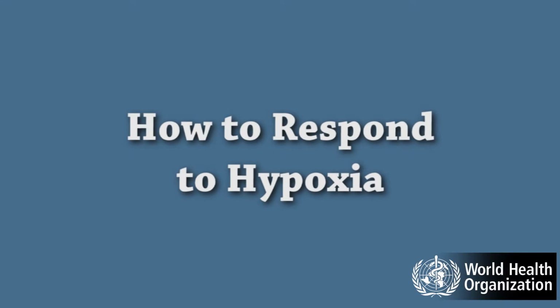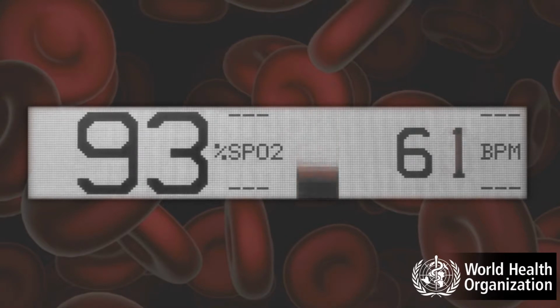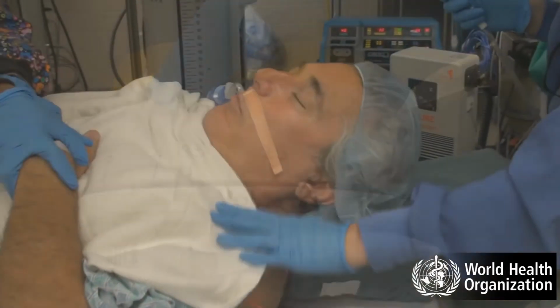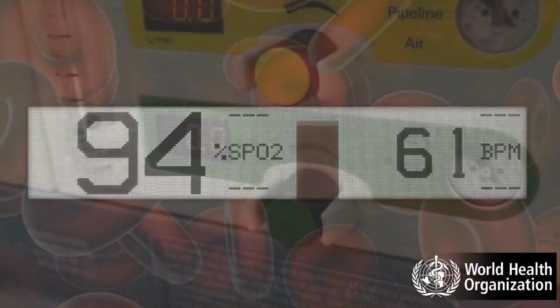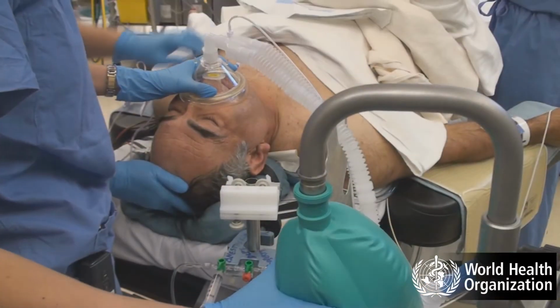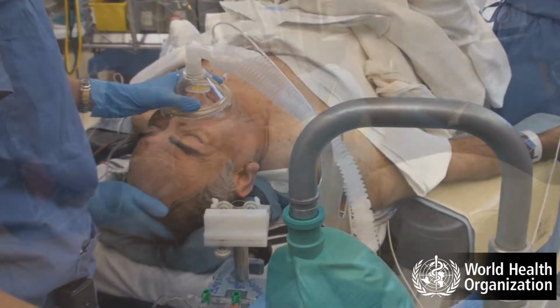How to respond to hypoxia. During anesthesia, low oxygen saturations must be treated immediately and appropriately. The patient may become hypoxic at any time during induction, maintenance, or emergence from anesthesia. If the oxygen saturation is 94% or less, the appropriate response is to administer 100% oxygen, manually ventilate the patient, and correct the underlying problem.